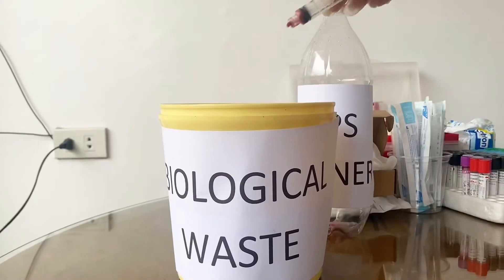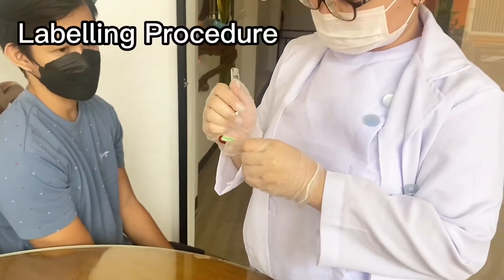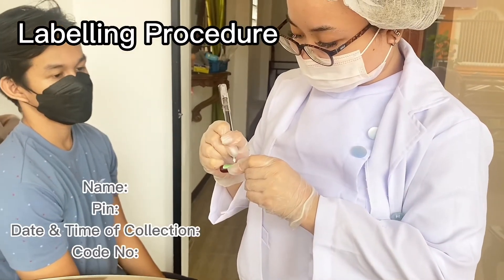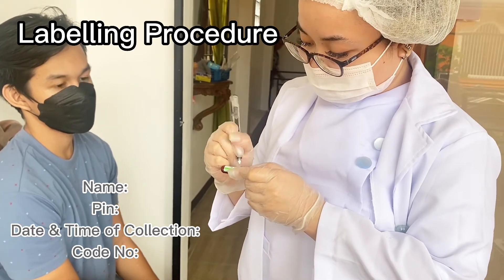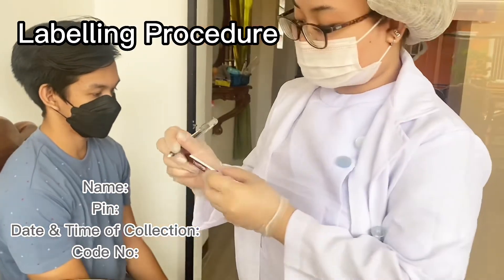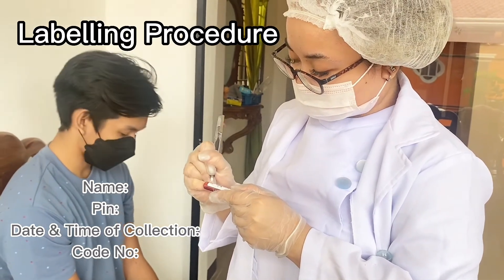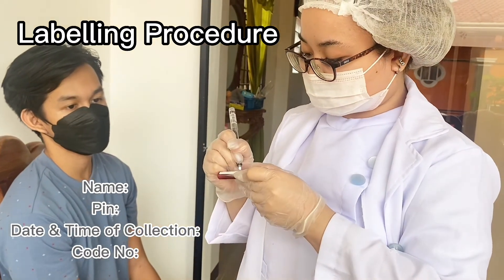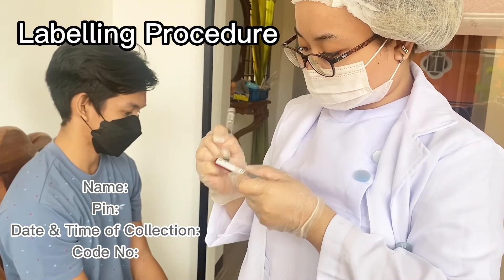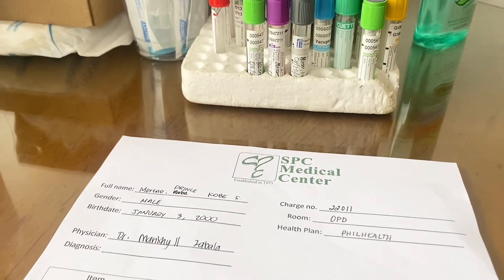Discard the used items into the appropriate category of waste. For the labelling procedure — the most important procedure — fill in the patient's name, PIN, date and time of collection, and the code number. Then prepare the sample for the test procedure. And that's it!